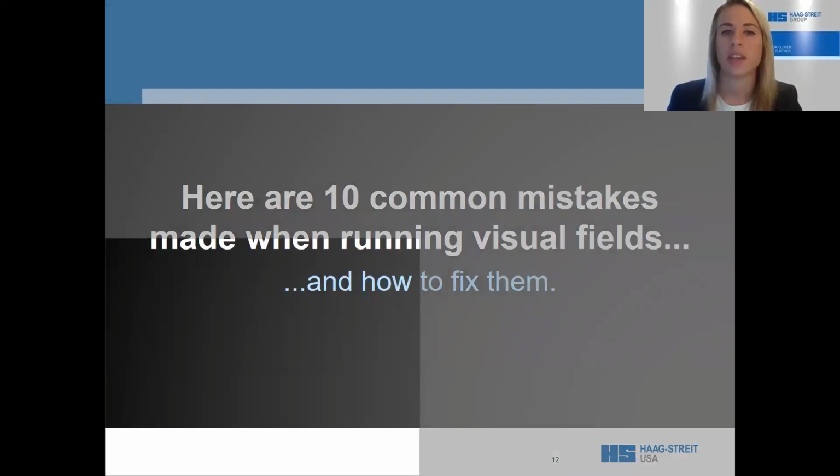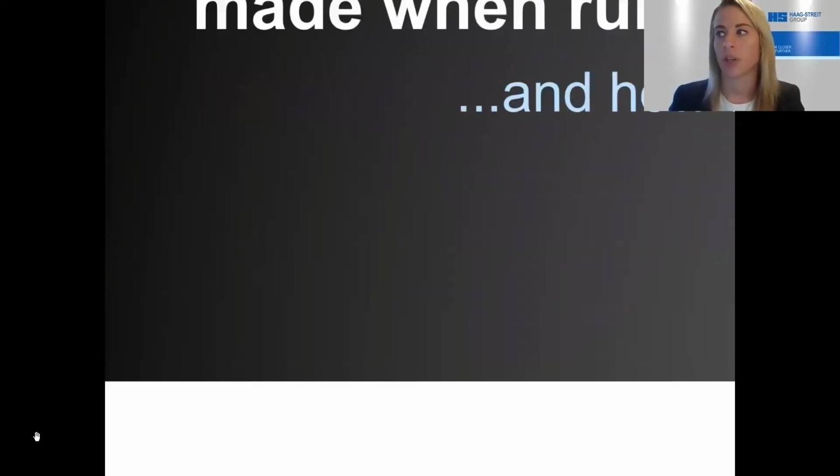Our first mistake that can be made, and one of the more important, is entering incorrect patient information. Now, what type of information do we need about the patient? We need to be able to identify them. So name is important.